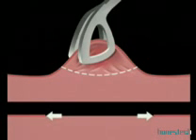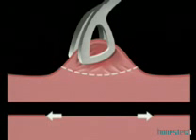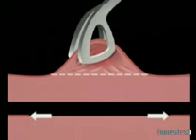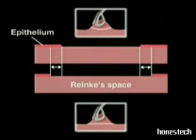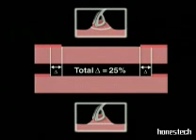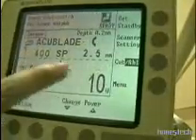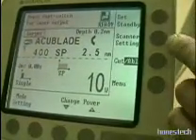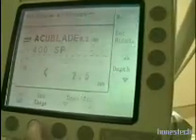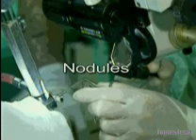The exerted traction stretches Reinke's space and the epithelium surrounding the lesion. A straight-line incision would require an exceedingly extensive resection of adjacent tissues and would needlessly expose Reinke's space and the vocal ligament. The AccuBlade control panel is sufficiently user-friendly to allow quick intraoperative parameter modifications if required.